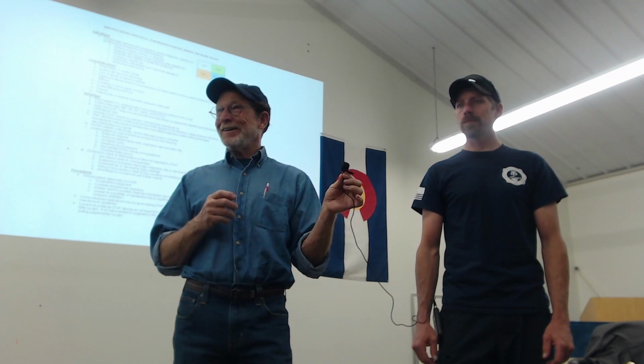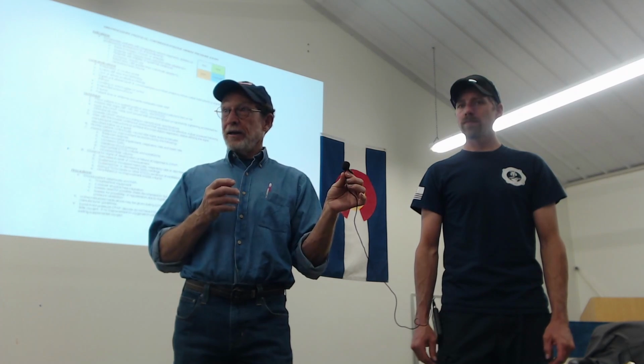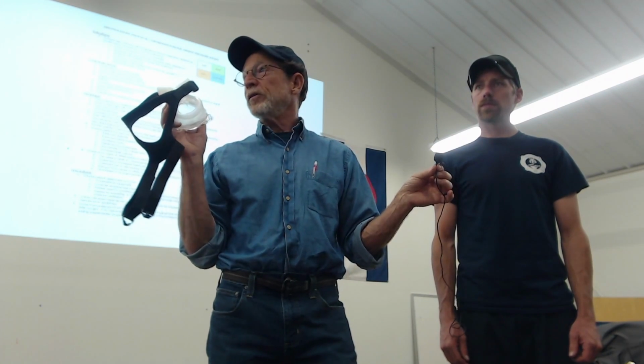You have to have a kid that's old enough, not panicked, and comfortable enough to work with you, because it really does take some coaching and some trust. Our pediatric patients are going to be a little fearful. So to your question, Andrew, yes, it can be used in pediatrics, but I would be thinking more of the 12-year-old or 13-year-old. Many manufacturers of CPAP devices make what they call a pediatric mask, a smaller version of this, probably for young adolescents, and certainly worth a try.